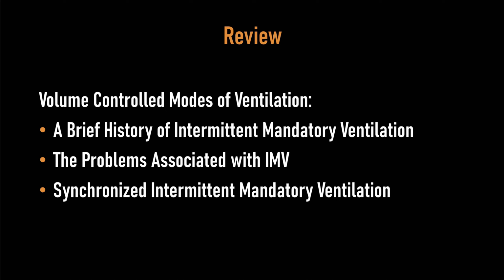We discussed initially how intermittent mandatory ventilation was developed essentially from ventilators that were used in the operating rooms. There were multiple problems with IMV, particularly breath stacking and the lack of the support for the spontaneous breath.